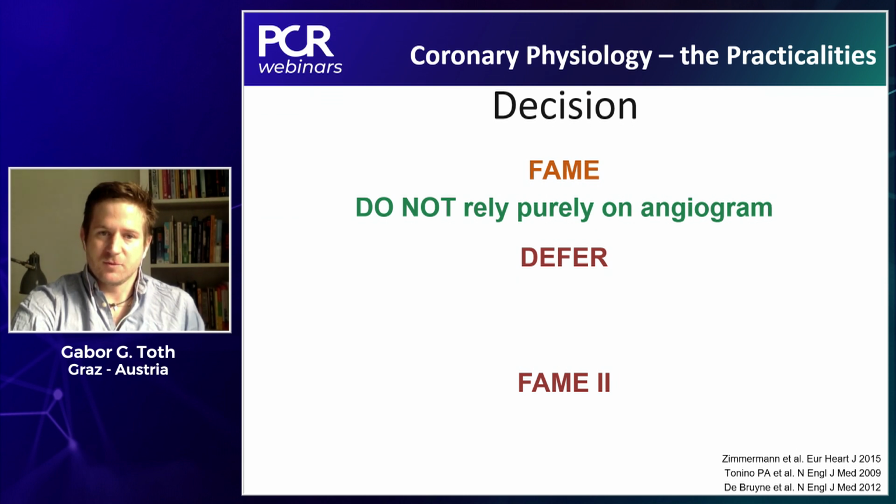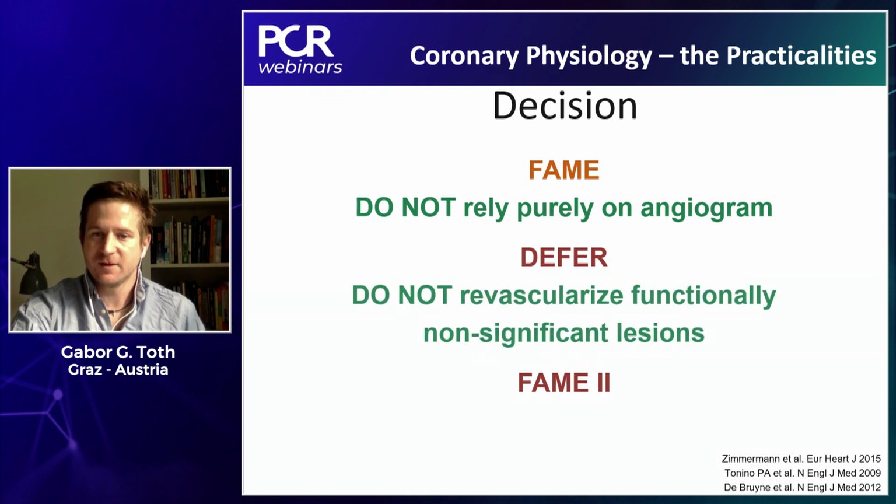When we make the decision, remember, you measure the FFR because you want to rely on the results. And how you can rely on the results comes from the key landmark trials saying that, first of all, you cannot purely rely on angiogram. We already agreed on this, and you will see some other examples during the rest of this webinar.